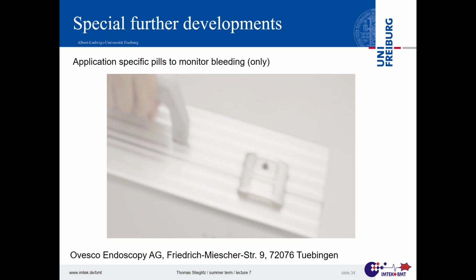And bleeding means we have to detect blood. Blood has a very particular absorption behavior in the infrared range. So if it's oxygenated, it has a different absorption behavior than deoxygenated blood. You know exactly at which wavelength you should look, and all the other stuff that is in there is more or less transparent to those wavelengths. That's cool. So you just detect blood because you know that somebody is prone to bleeding.